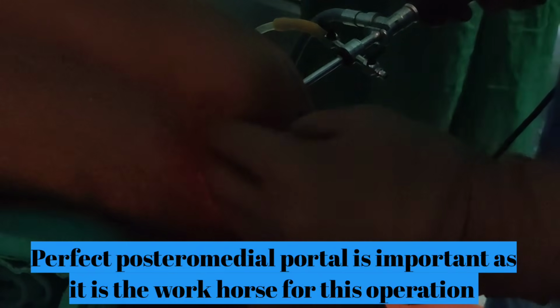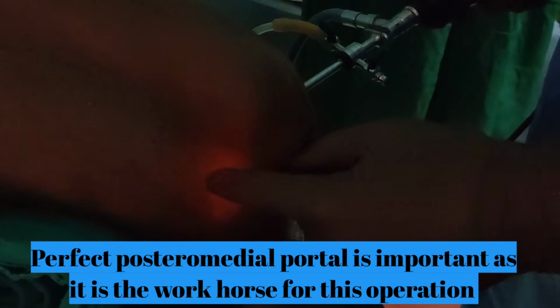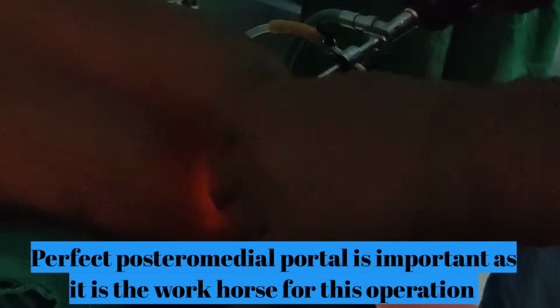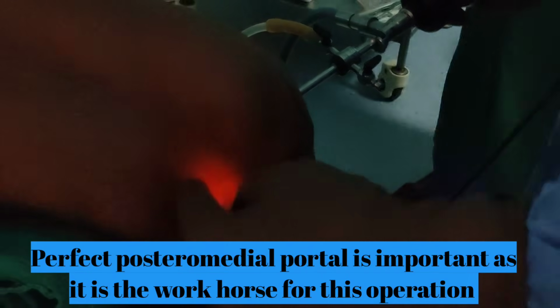So what I wanted to show you is that my scope is still in the anterolateral portal. Now if you see this transillumination, this will give you some idea about where your posteromedial portal will be. Now the key of the portal is don't be too close to the femoral condyle, because you need working access, and also you don't need to be too low, because then you need to work behind the back. So it needs to be high. So I'm just going to poke it here, and I'm going to show you how it looks on the screen.